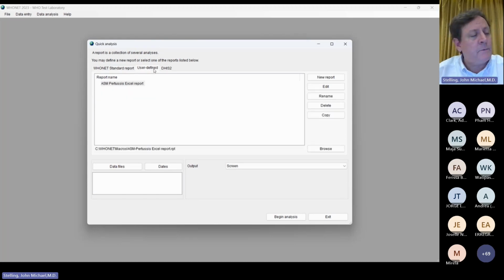This was the subject of one of our webinars back, I think, in November or October. I don't remember which. I think it was October. User defined. I want to make, for example, a new report.